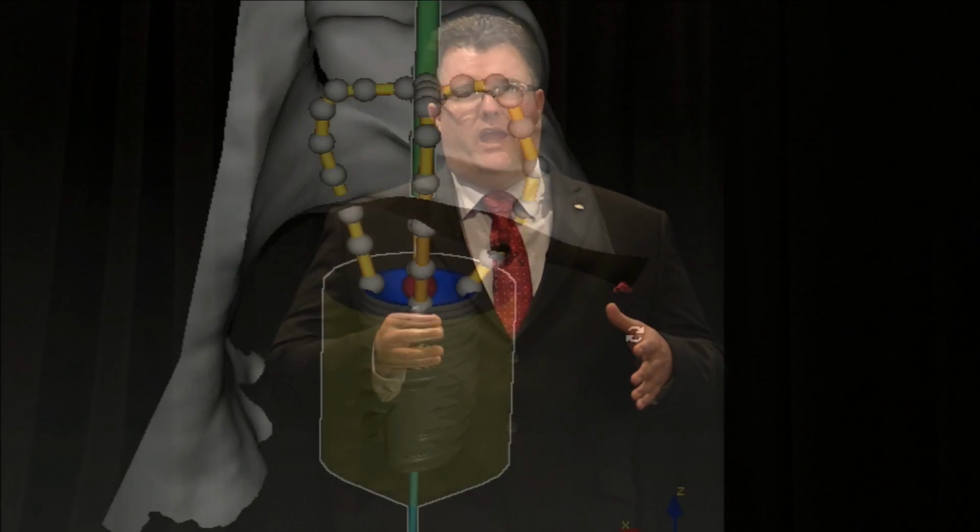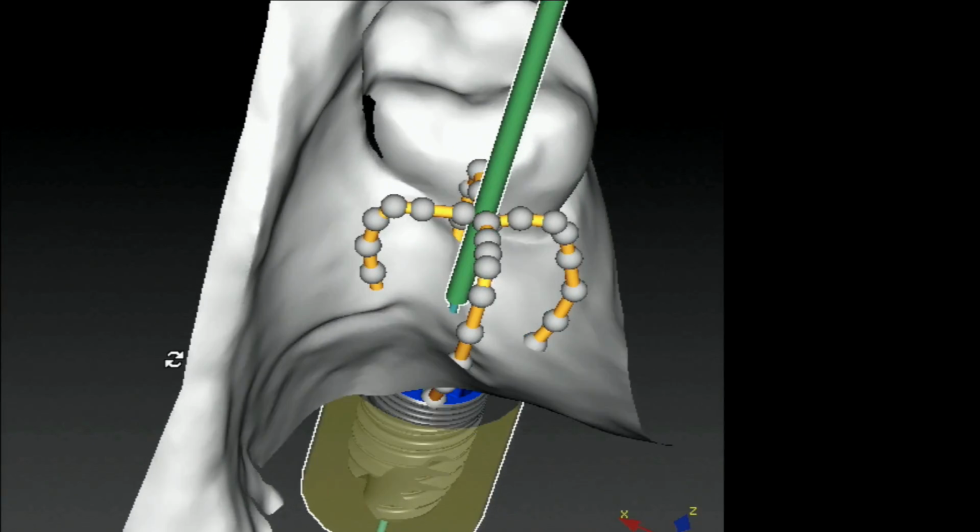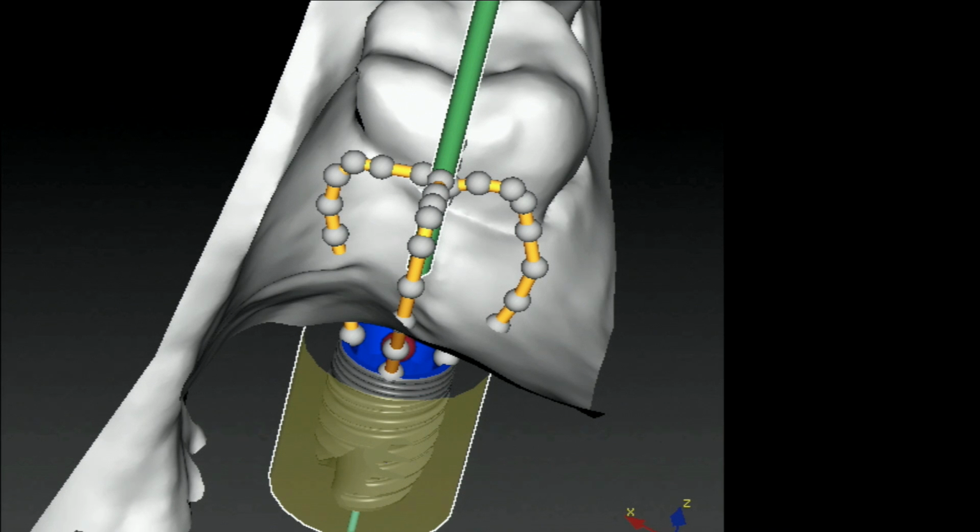If we go too wide, it's the buccal-lingual dimension that limits us, because we don't want to go too wide and come out of the buccal plate or have limited soft tissue cuff around. I want to have that 3 millimeters of soft tissue cuff around this implant. I feel that's what's generating success with the platform shift and the conical connection.